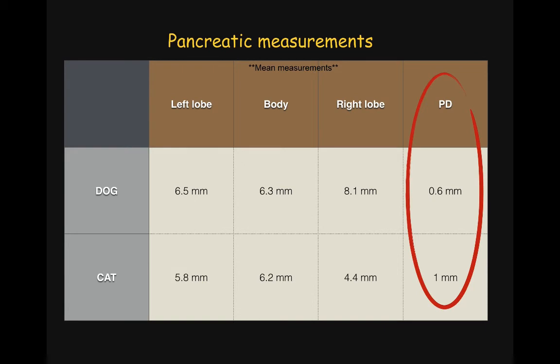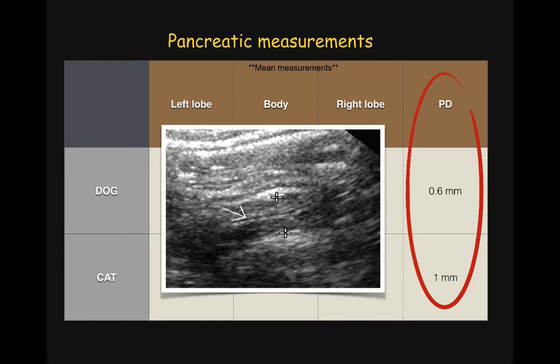The pancreatic duct can be seen in both dogs and cats, but it's often more obvious in older cats, especially as they get older. See the thin anechoic tubular structure that represents the duct in the left pancreatic lobe of this normal cat.